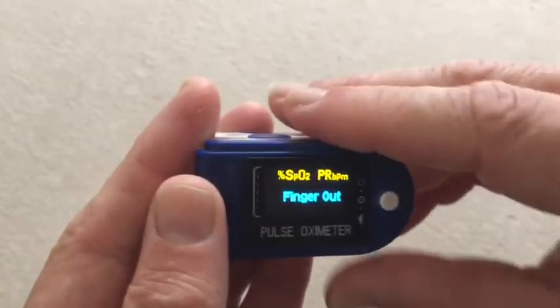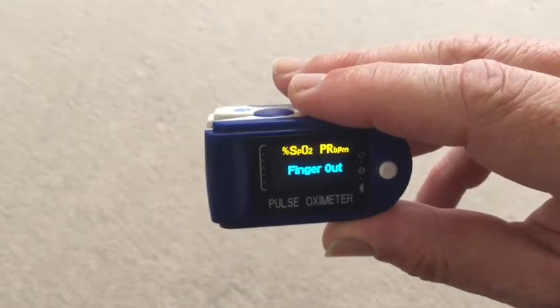It's got a handy auto power-off feature — I'm not touching anything here and it turns itself off.